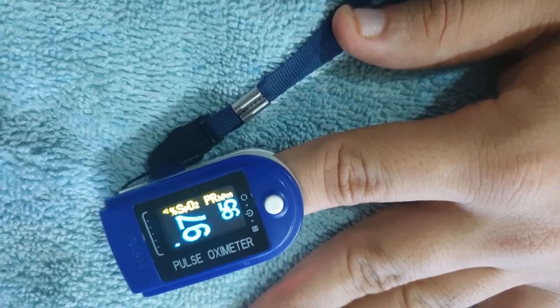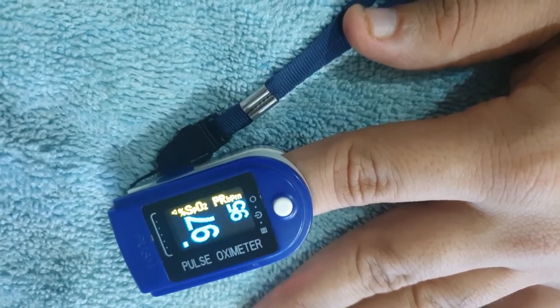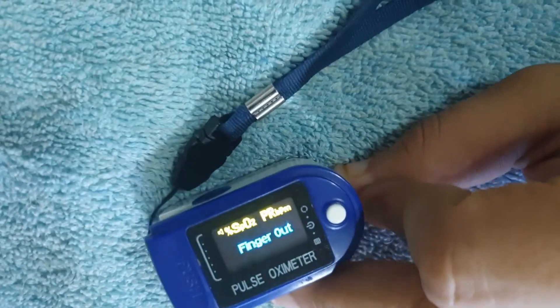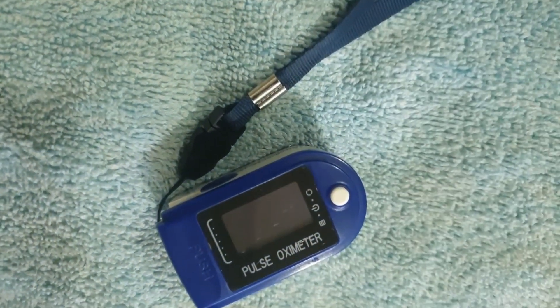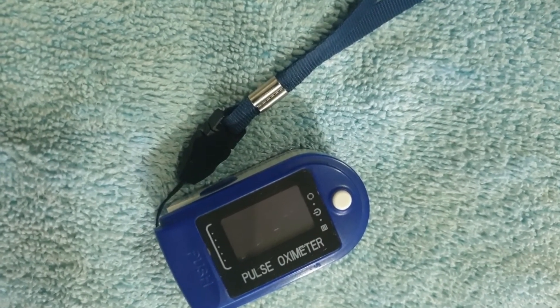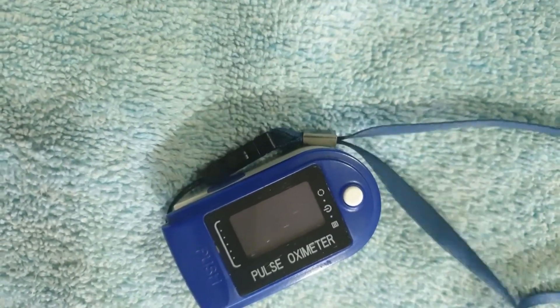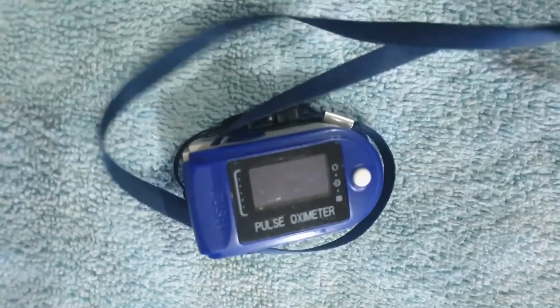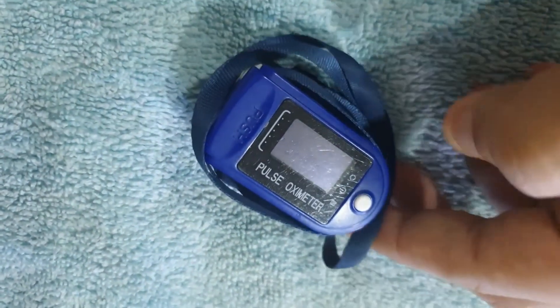Also, if you move your hand frequently or are not sitting still, the readings won't be accurate. Always measure pulse ox two or three times per day and keep a record. If there is a home isolation patient, keep a diary for the record. This is a very simple and very good instrument, easy to use and readily available. Don't be shy to purchase one. You should also purchase a thermometer and a mask for prevention of COVID-19.